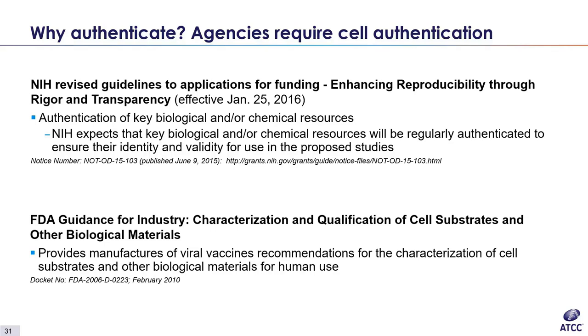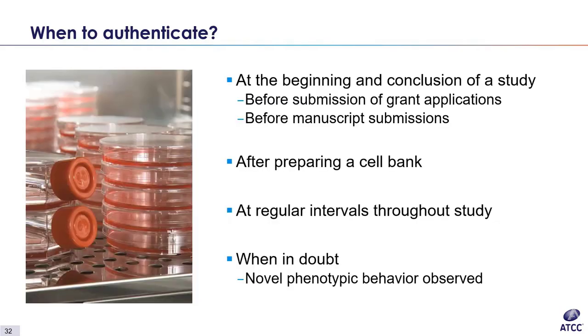So we have covered the importance of cell line authentication and the requirements that have been set forth by major government agencies and publishers. I will now go over when to authenticate your cell lines. Firstly, it is important to obtain cell lines from a reputable source, a biorepository like ATCC, where our products go through extensive QC testing to ensure our cell lines are authenticated and free of contaminants.